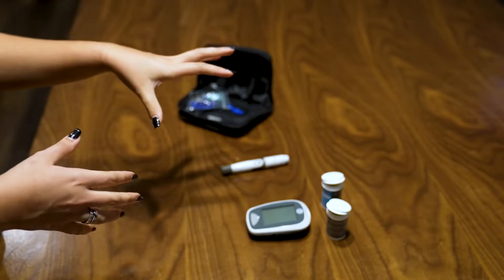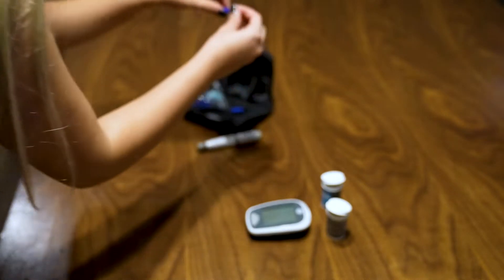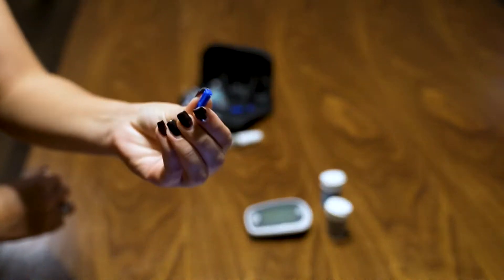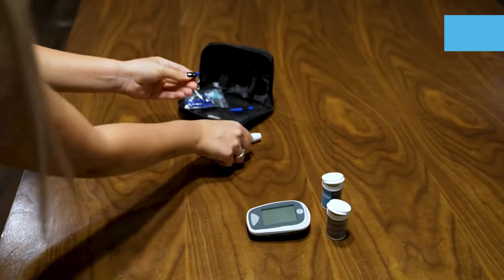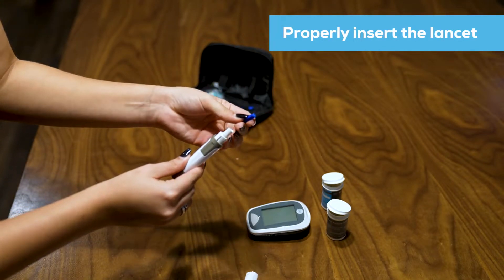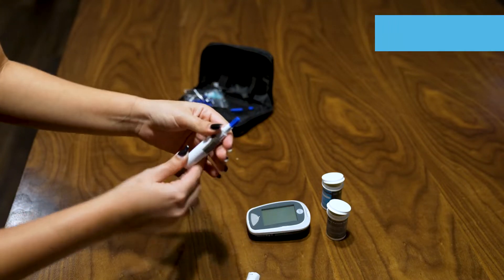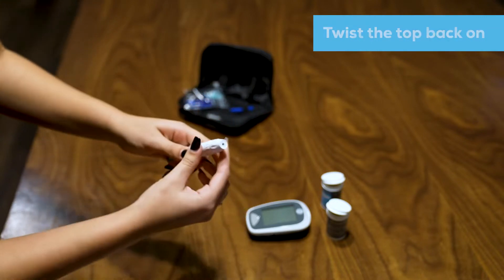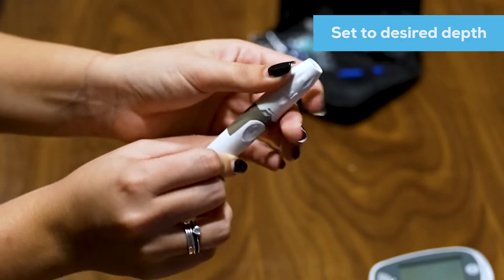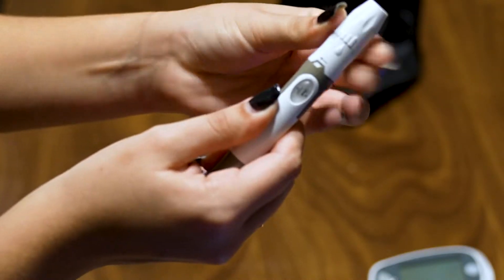I'm going to properly insert my lancet device. I'm going to pop it out, twist it, pop it out. Then twist it out here and put it in. Put the cap in. And then you're going to set it to the depth that you desire. Mine looks good enough, so I'm just going to leave it the way it is.